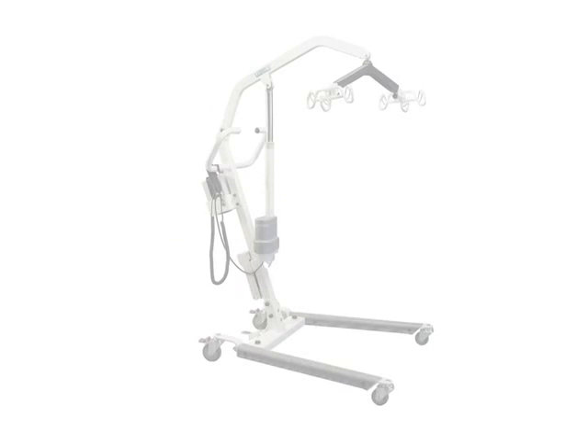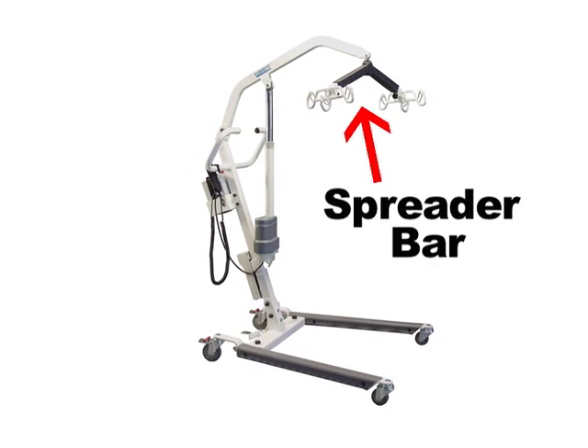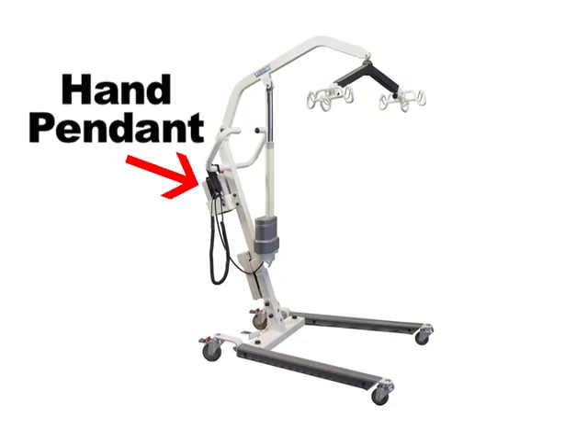Your Lumex lift is constructed of heavy gauge steel. Let's review the parts: base, mast, boom, six-point spreader bar, push bar, emergency lowering device, motor actuator, control box, and hand pendant.